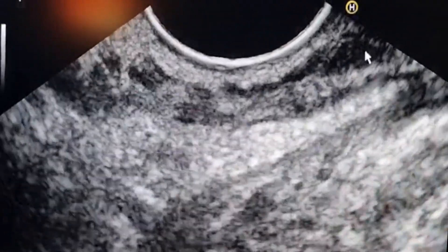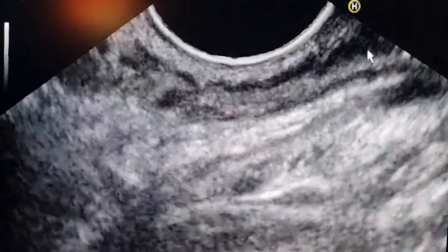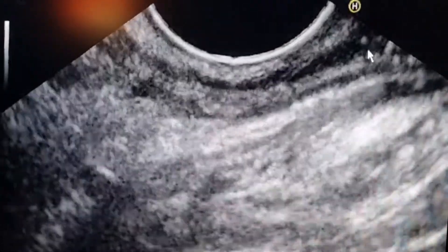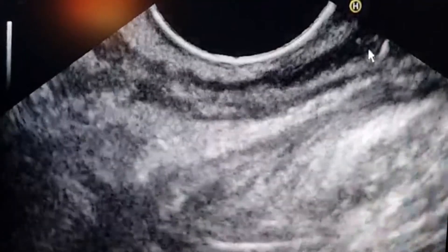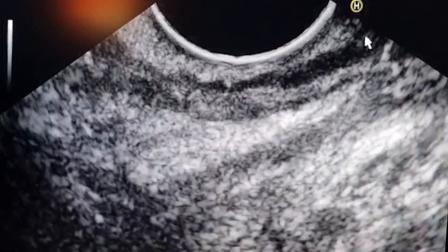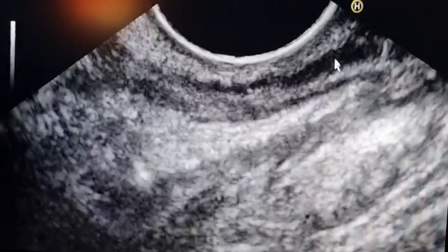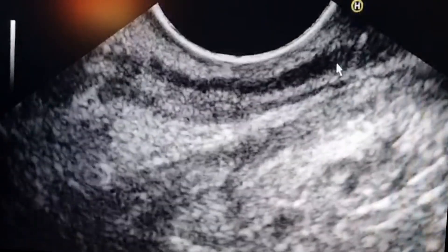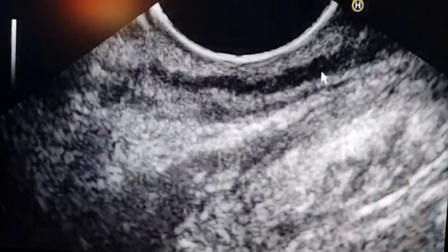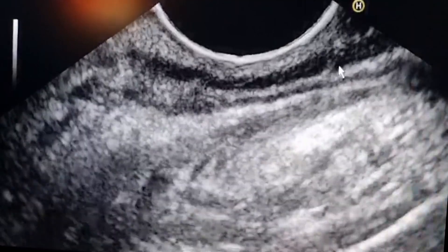Now when we withdraw toward the region going to the anal canal, the circular muscle layer will increase in thickness. It is increasing in thickness — this is the internal anal sphincter, showing increase in thickness.